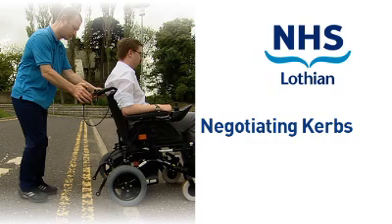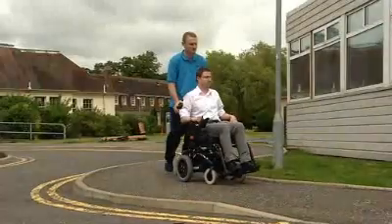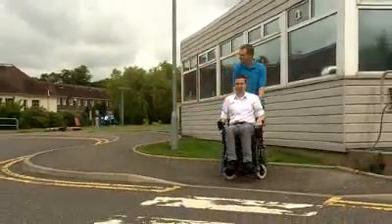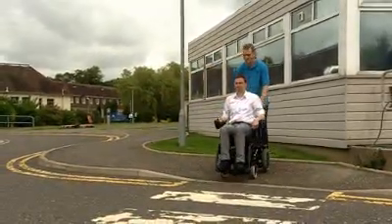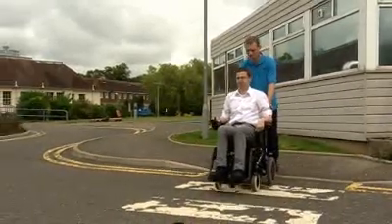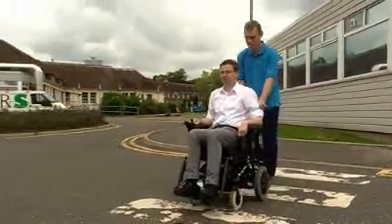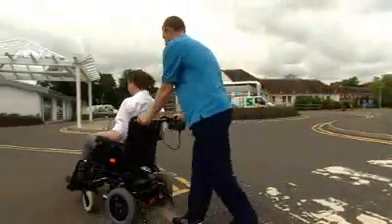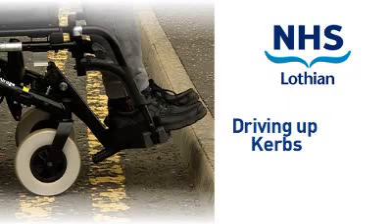Negotiating curbs. Always approach slopes straight on, not at an angle. Cross roads at a pedestrian crossing or, if there is no pedestrian crossing, cross where there are dropped curbs. Driving up curbs.